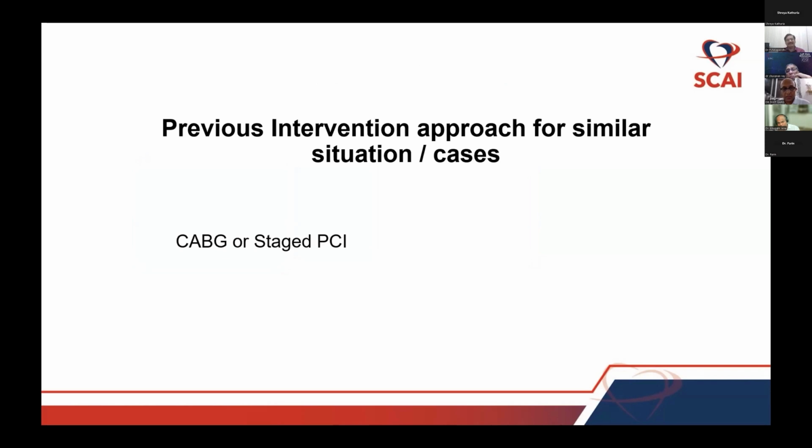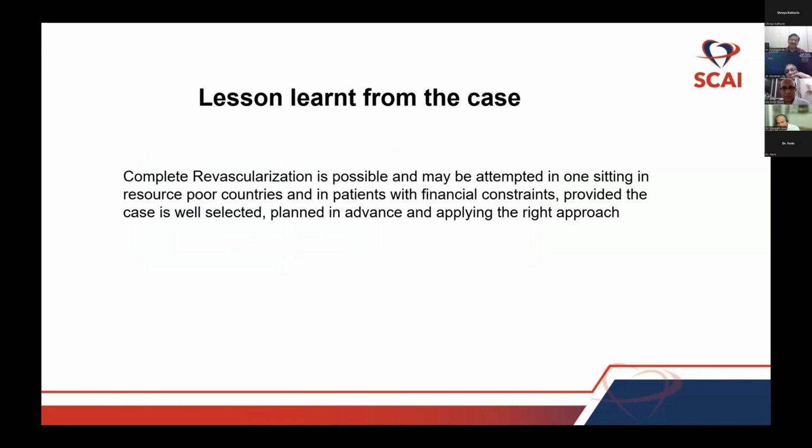The lesson learned from the case was that complete revascularization is possible, and it should maybe be attempted in a single sitting in resource-poor countries and in patients with financial constraints, provided we use the right approach and advanced planning.